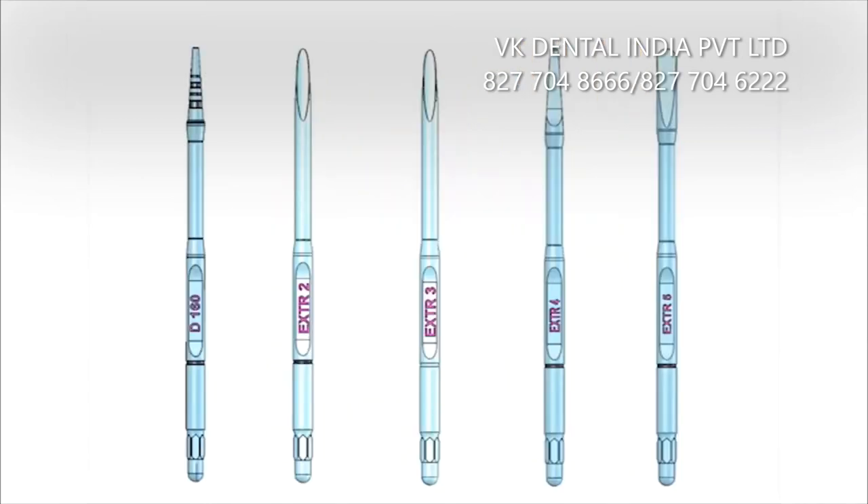The latest optional instruments include a 1.6mm bone expander for bone expansion and compression, and new instruments for roots and abutments extraction.